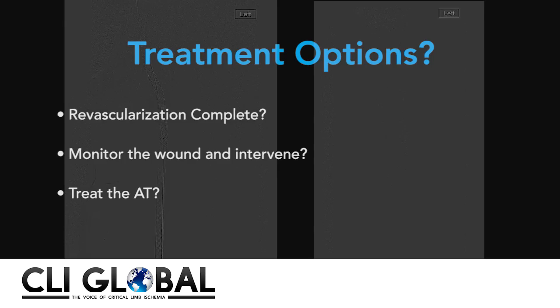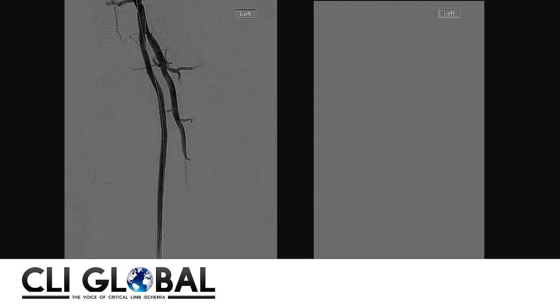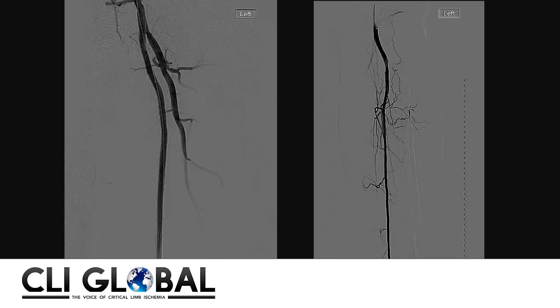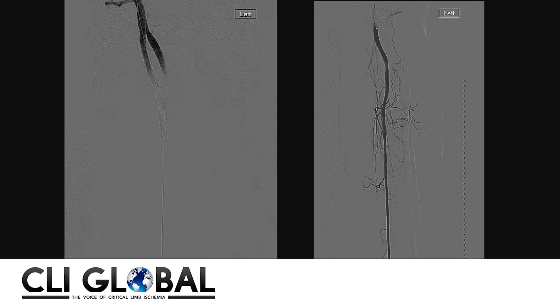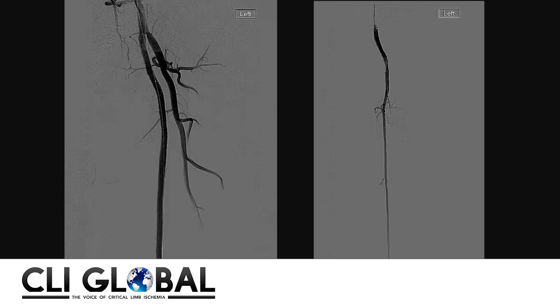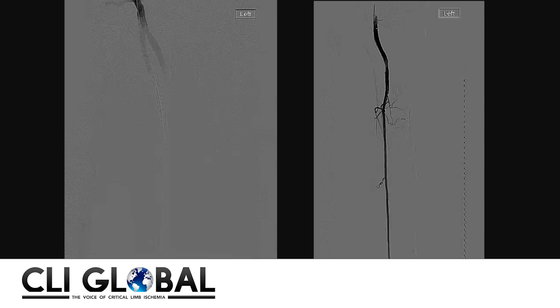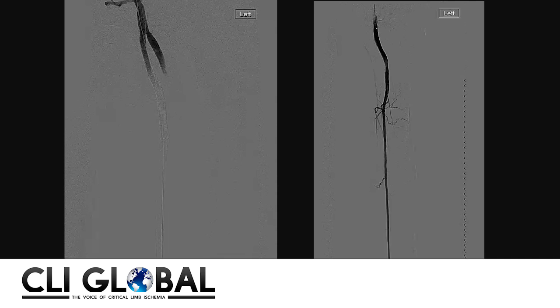These are the diagnostic images 48 hours post procedure. You can see there is brisk blood flow, and the patient's rest pain has resolved completely. In fact, he was complaining of some edema and swelling, which is not unusual in patients with critical limb ischemia and rest pain — they have significant blood flow that overwhelms their venous system. To the right of the screen you can see almost a hint of the anterior tibial artery.